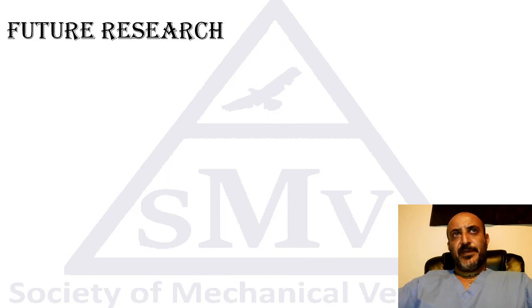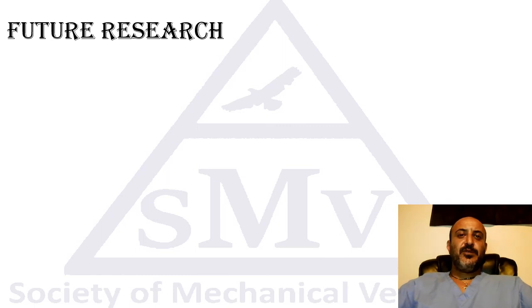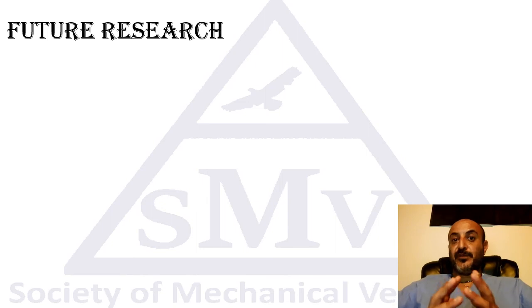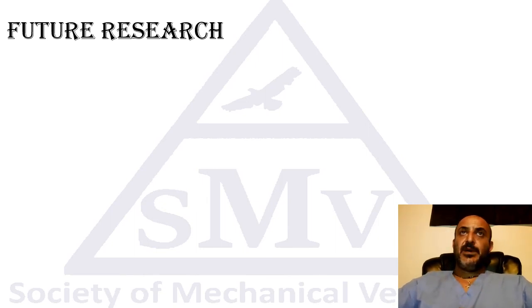Some questions we need to answer, and that would be good for future research. We still need to understand more how APRV works. We need to see what's happening inside, whether with an esophageal balloon or maybe with electrical impedance tomography, to see the difference between ventilation and perfusion. Maybe we need better research comparing different settings in APRV. We definitely need more education in APRV and more understanding.